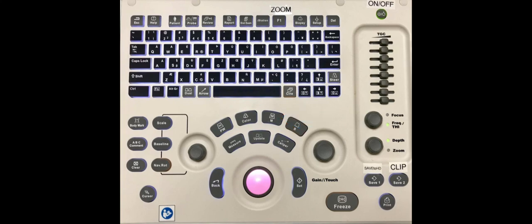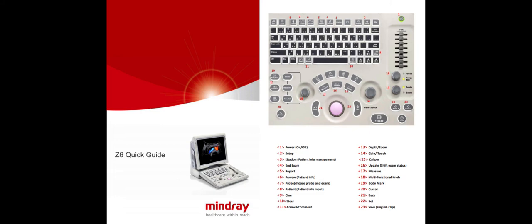There are numerous other buttons on this keyboard, most of which are unnecessary for the novice user. Full details can be accessed using this link to the Mindray Z6 Quick Guide. And this completes the Machine Knobology video.